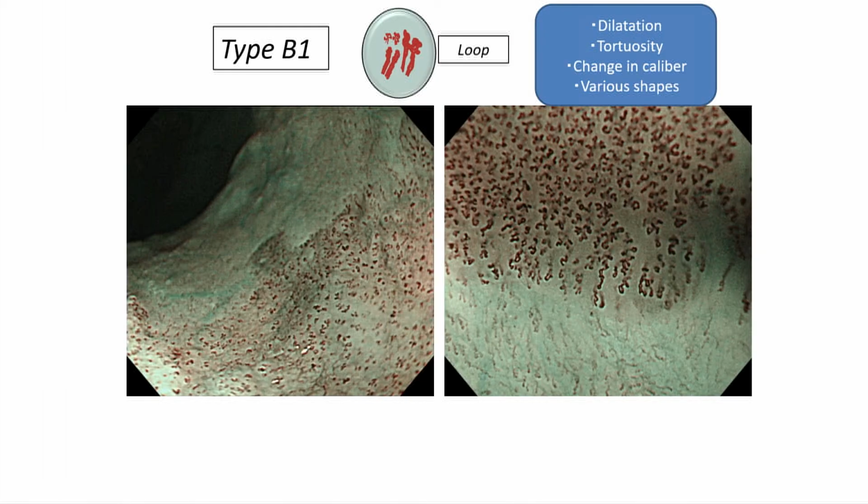Now look here, two things have happened. This is what the Japanese called an area formation. It has found a focal area, it's not diffuse. It's found this focal brown area in which you find this. This is suspicious. This may be moderate. And here it is much more, and now they have become a little elongated.